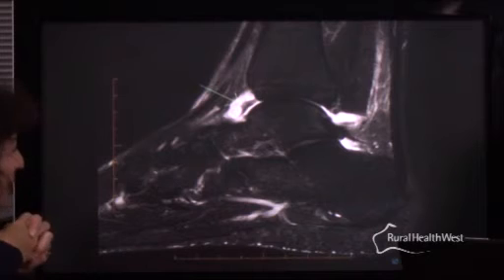Rodney, I was quite worried about this patient. He's very fit and looking at a semi-professional career in basketball, so I elected to send him straight for an MRI scan, and fortuitously the MRI scan is arrow sign positive. Could you just tell me what I've got there?